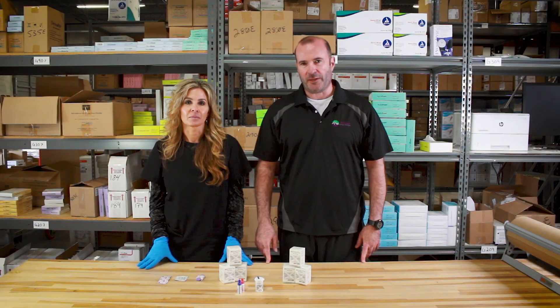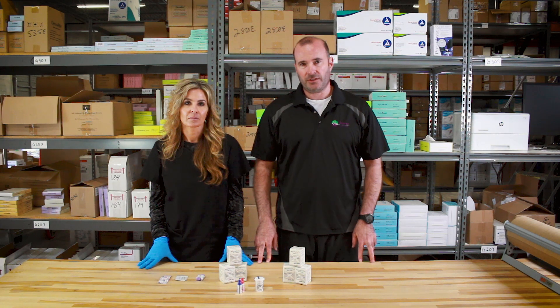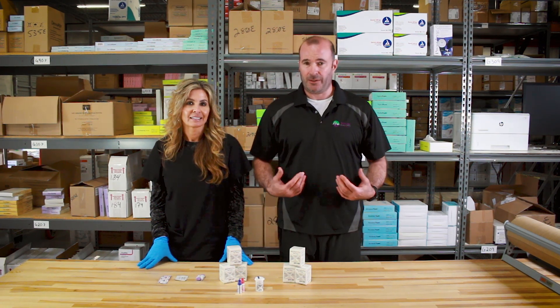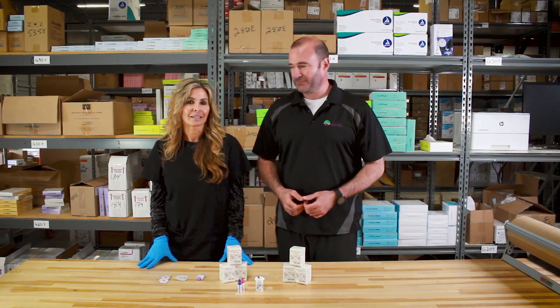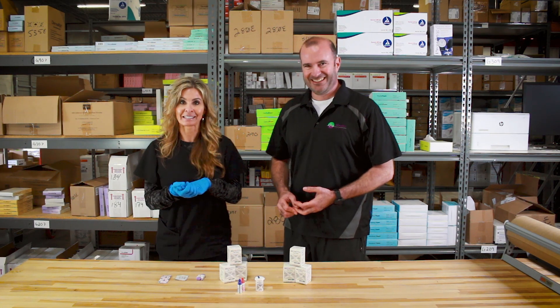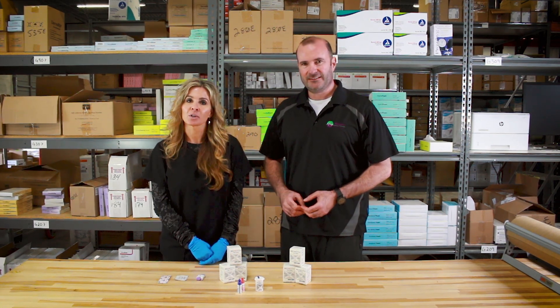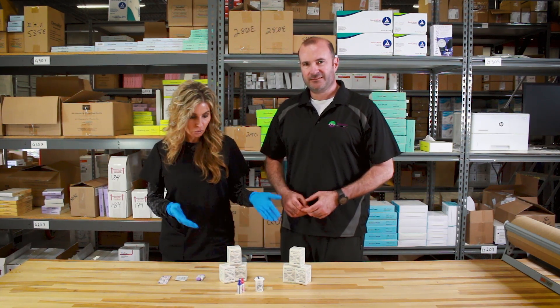Hi, it's Dave and Dev again from the Medical Maven, and today we're here to talk to you about the Microdot Extra Glucometer. For you diabetics out there, I have the pleasure — I'm not diabetic — of having Deb stick my finger today to show you how it works. But his blood sugar is borderline up there, so this will be an excellent experiment. Microdot is from Cambridge Sensors, located up in the Boston area.